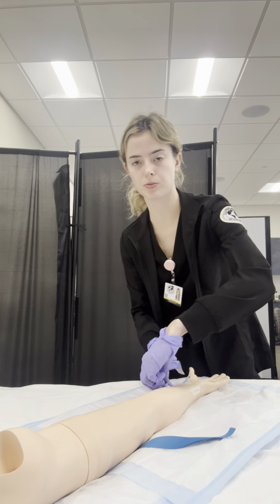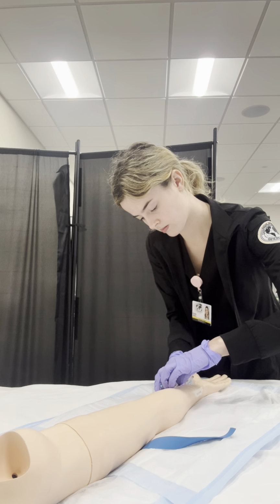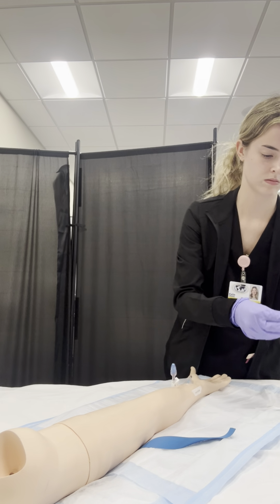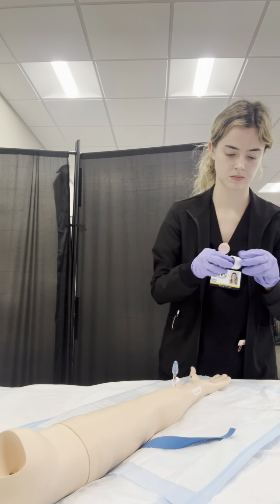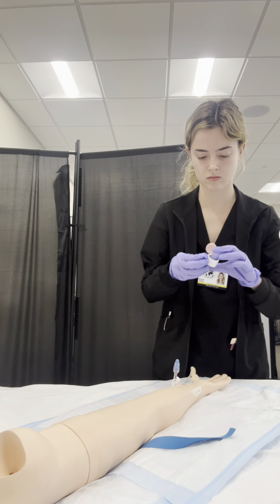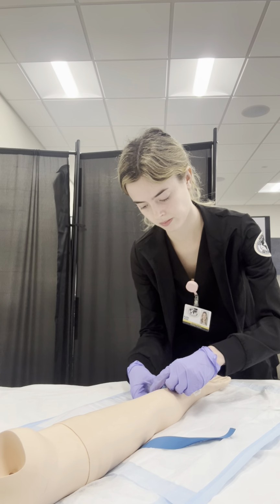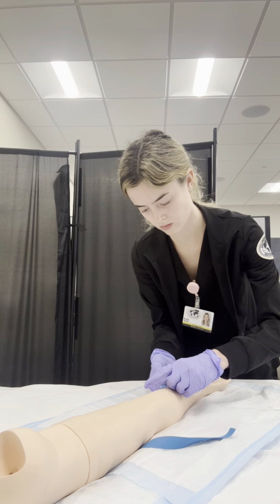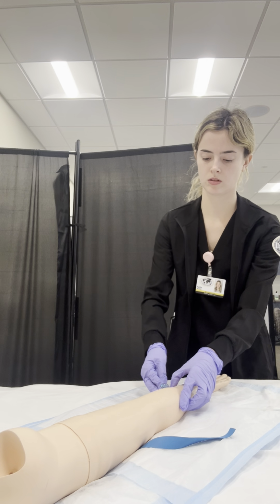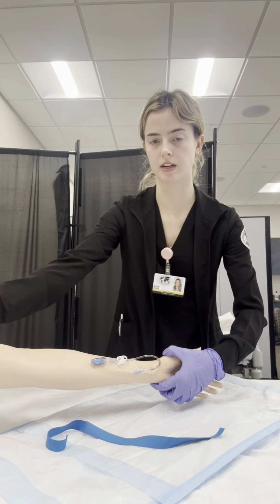So we're just going to take the J-loop, we're going to attach it just like this. So it is firmly secured on the side of the arm.